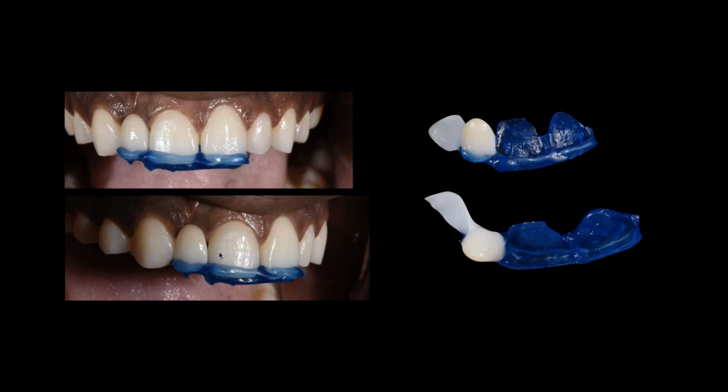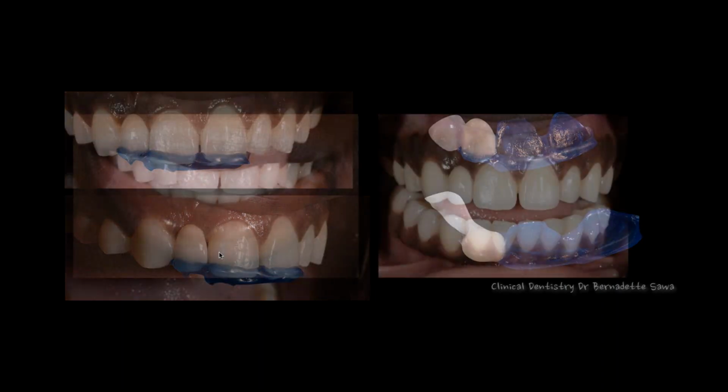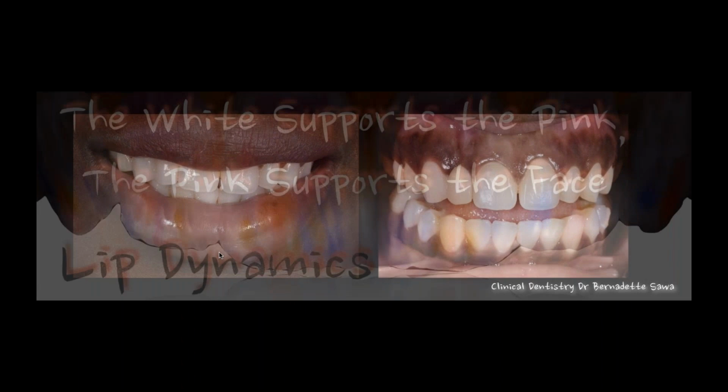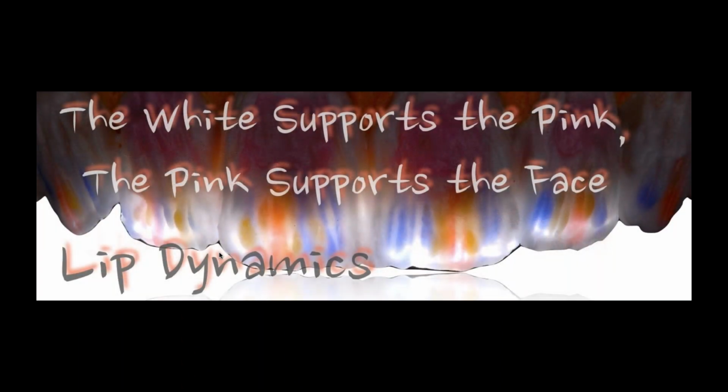So again, the communication part here isn't just about the shade and the color. Now it becomes about the space and how we help the clinical partner seat the final restoration, because we know it's not going to be easy for them to seat, managing the fact that it's going to have no contact on the distal, that we're going to modify the tissue, and that there's only one wing holding it on. So again, it's a communication tool that becomes really important for us, and that's not just about the camera.